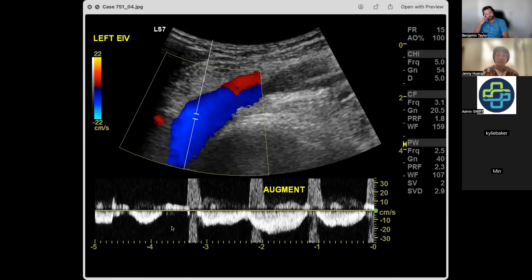Okay. So, great. Particularly for those sitting the exams, you are meant to be able to describe the findings in both normal and abnormal with these dynamic maneuvers, be it respiratory or Valsalva, and with augmentation, and be able to rattle off a list of causes as to why you will lose those expected responses. All right, so in this case, we've said there's a problem.